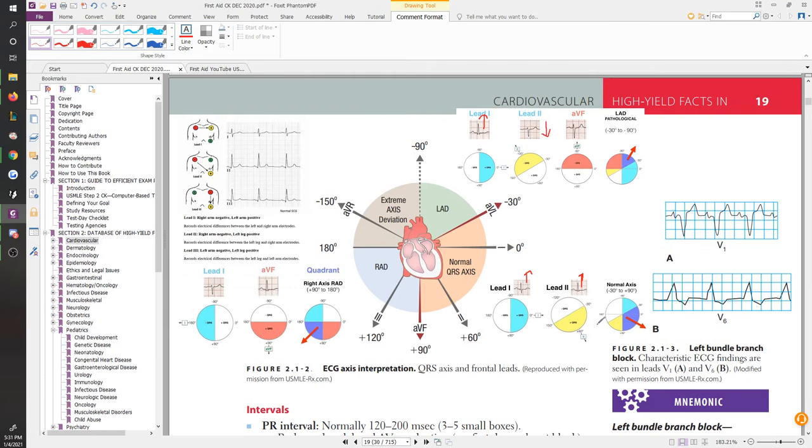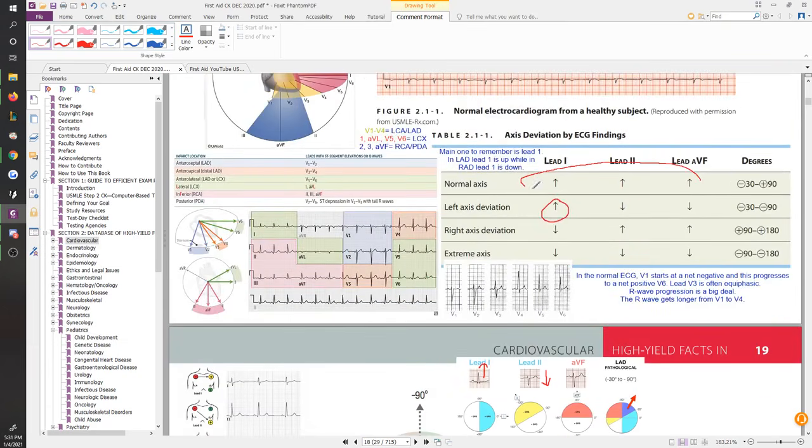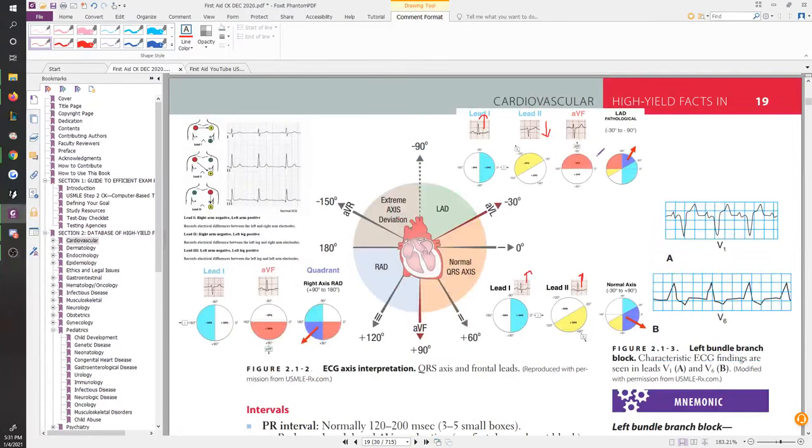And if you overlap these guys, the purple area now becomes this upper area over here, which is going to be your new axis, and that's pointing upwards. Right? It's going the opposite direction of what was normal. So the normal axis had everything pointing up. All three of these guys are pointing up. Now here you can see AVF is also pointing down. So when you look at an ECG and you see that in 1, 2, and AVF, 2 and AVF are pointing down, that's not supposed to happen, then you know immediately a person has left axis deviation.